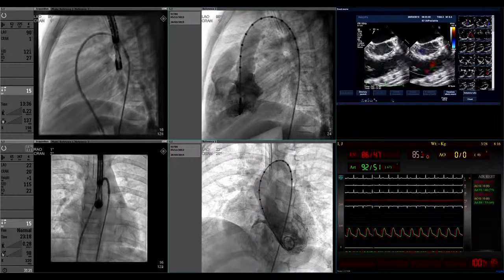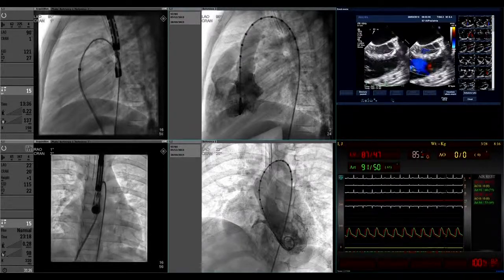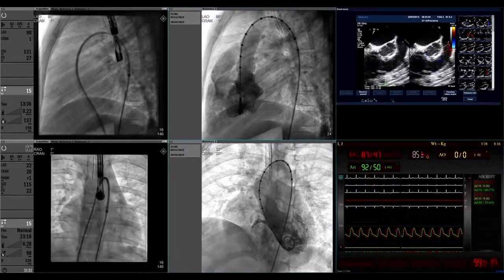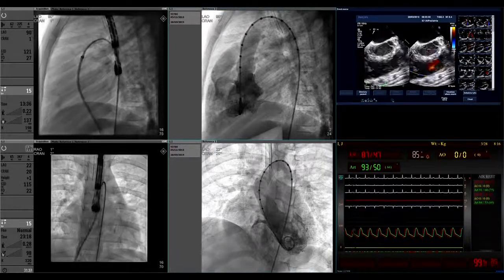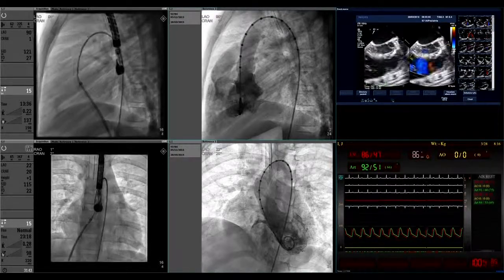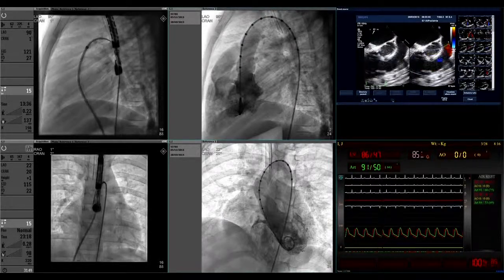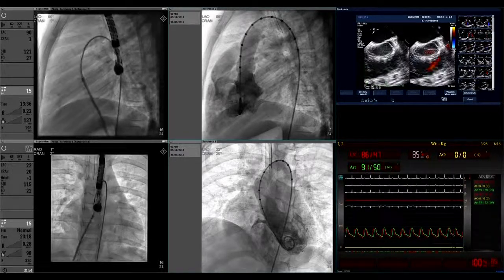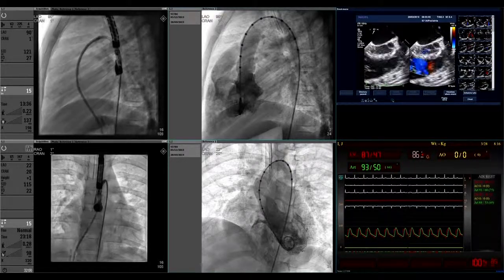So what size ADO1 are you planning to use? Your echo dimension was 5 and your angiography was a little less than that. So would you go for an 8.6 device? I think a 6.4 would. Yeah. But we also intend to use a 6, and for this reason I use the delivery system 6 French to advance across the defect, and because of the different size between the echo and the angio, we will do the angio now after crossing with the delivery system.